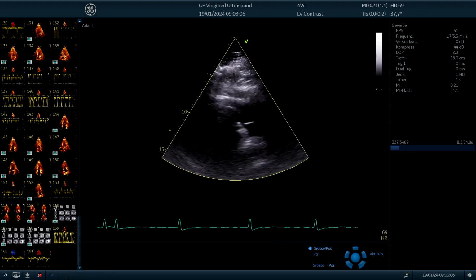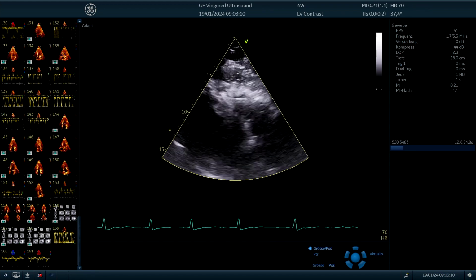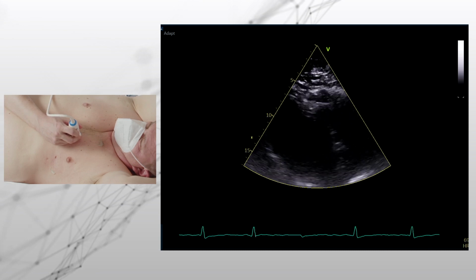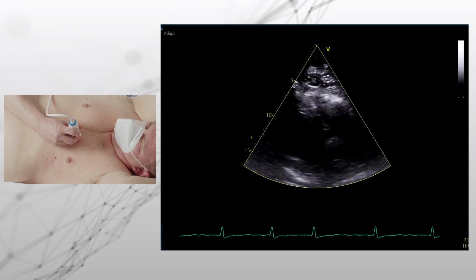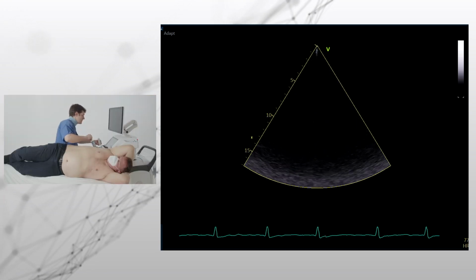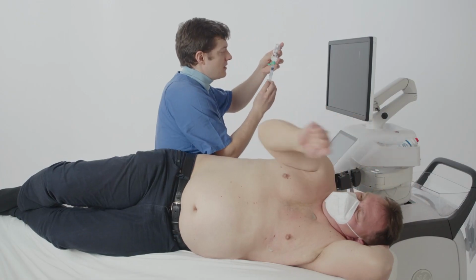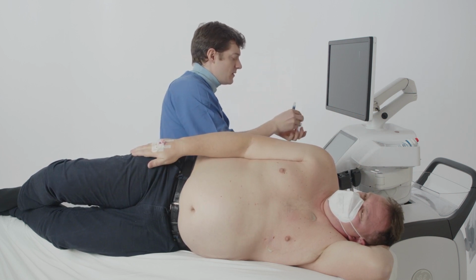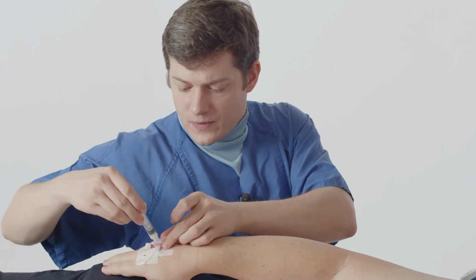I just want to show you a normal B mode, and you see that this is all very blurry. That's the optimal contrast preset. So you see that the mechanical index, all the gain settings and much more settings are optimized for the bubble study. So this is a left ventricular contrast imaging. So we now use the contrast agent. We only need 1 milliliter, not much more. We just take it out and then we administer it to the patient.